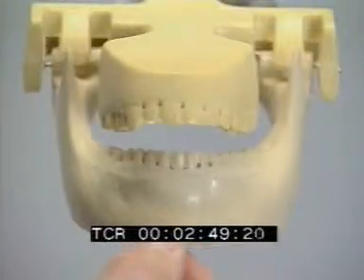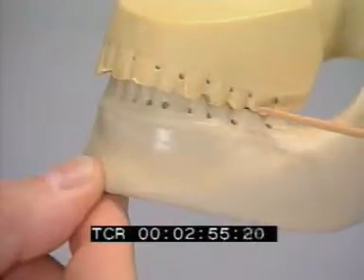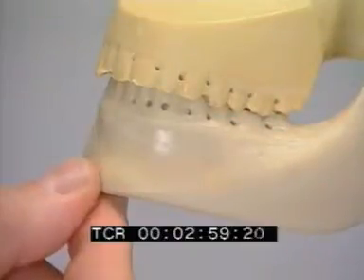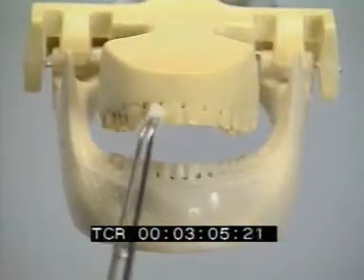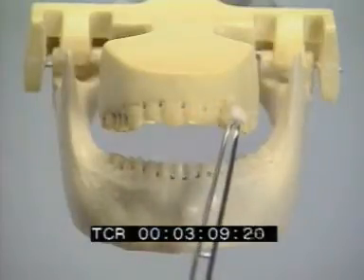Before inserting the arch bars, the occlusion is checked. There should be full interdigitation of the teeth with regular contacts. Fluoridation takes place before starting the arch bar fixation to prevent demineralization.